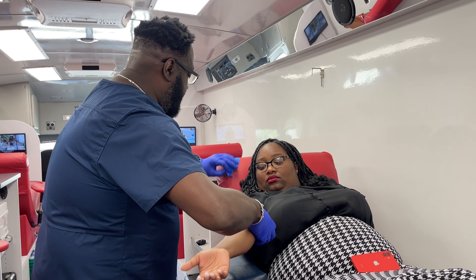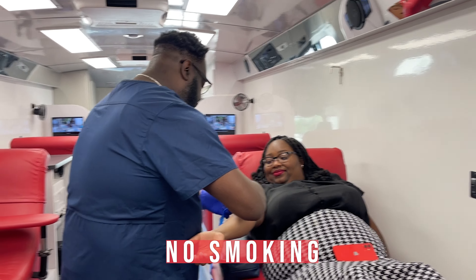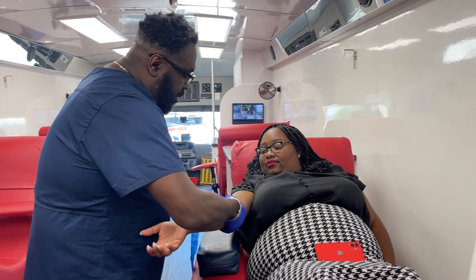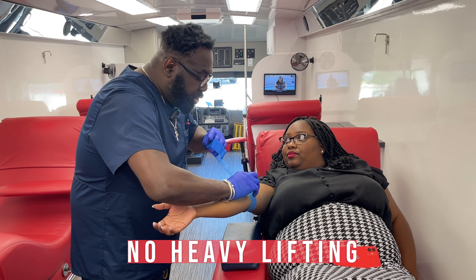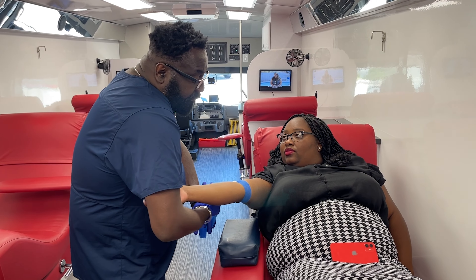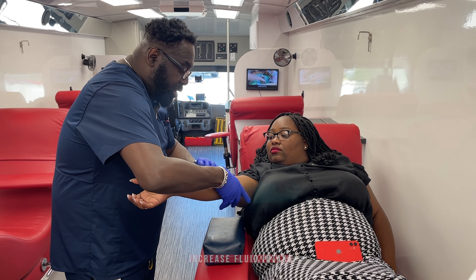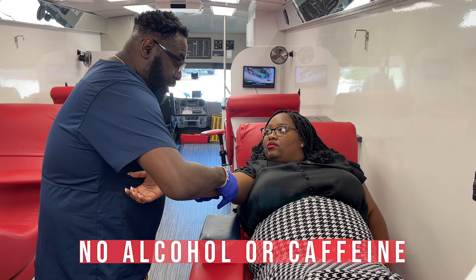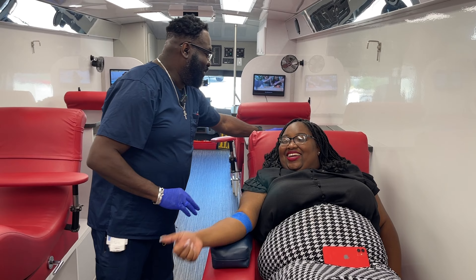Just lift it up a little bit for me. We're going to keep the wrap on for 30 minutes after you're done. No smoking for the next four hours. We're going to leave the band-aid on for the next six hours. No heavy lifting or strenuous activities for the next 24 to 48 hours. Increase your fluid intake — not with caffeine or alcohol — and make sure you eat well today. Thank you so much for coming in, we appreciate it!